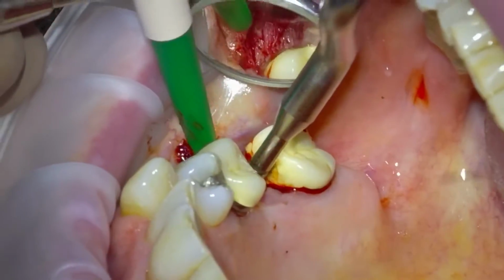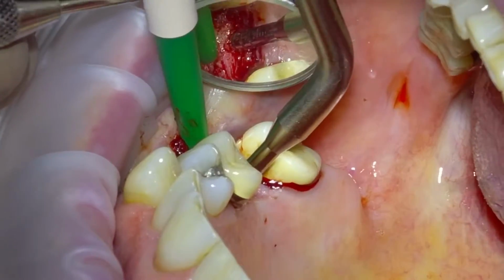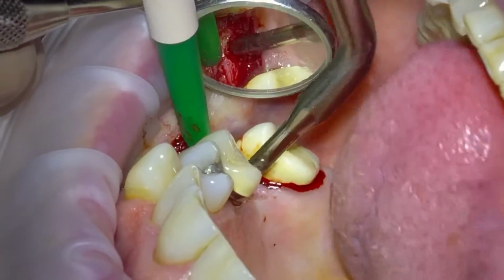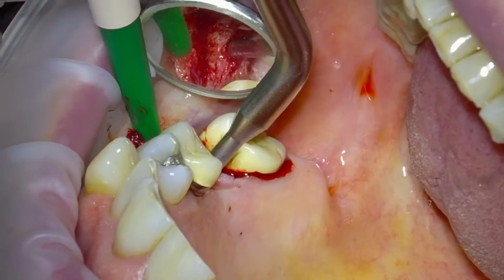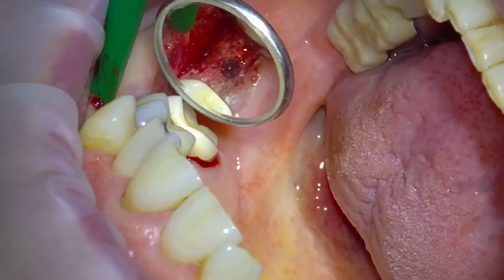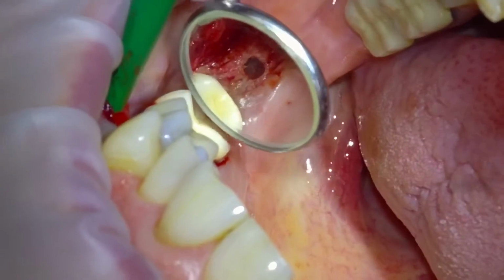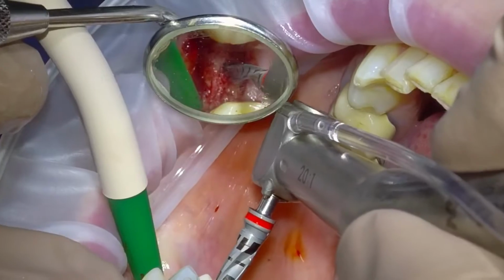This is my little osteotome, and then we can just check that we've got a good apical stop. This is a Straumann osteotome from the Straumann osteotome kit. I've had it years, fantastic bit of surgical instrument. You can see the 3.75 diameter implant sits beautifully in this crest with good mesiodistal bone as well as buccopalatal.